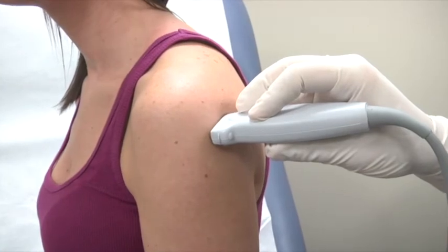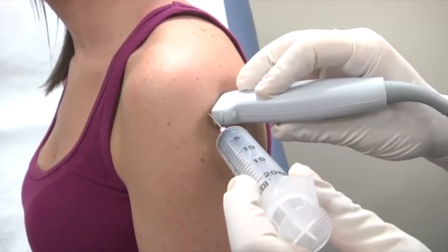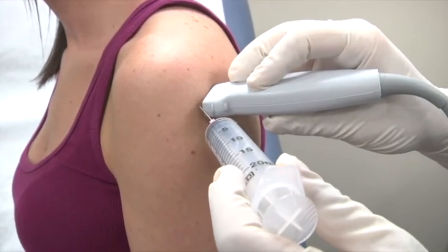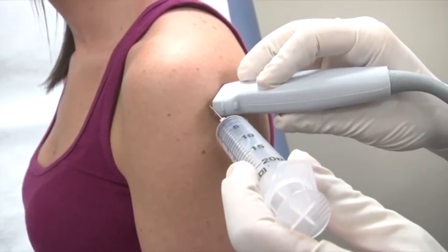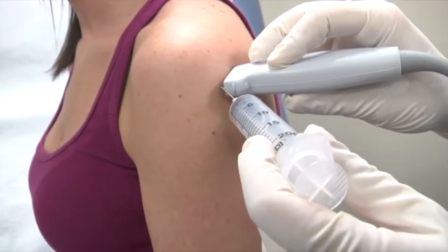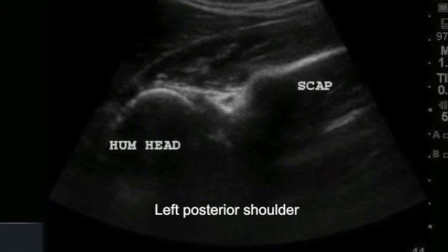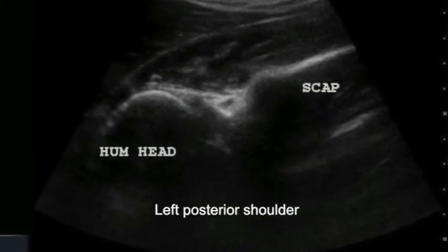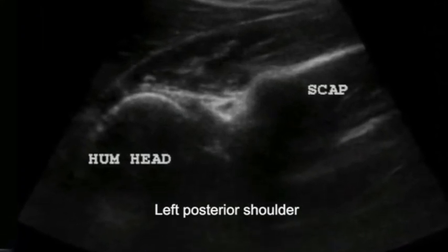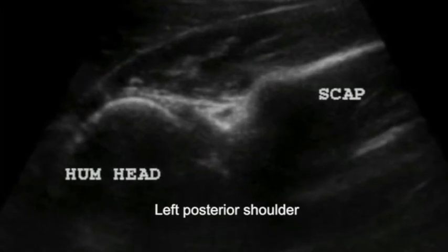Place the needle lateral to the ultrasound probe and direct medially towards the fluid collection so you will visualize the needle in plane. Your target is the groove between the medial humeral head and the glenoid rim. Direct the needle toward the effusion and visualize aspiration. Aspirate as much fluid as needed for diagnostic and symptomatic relief. Remove the needle and place a clean dressing.